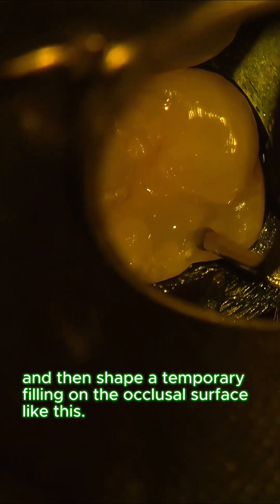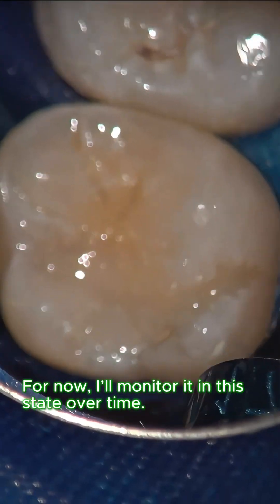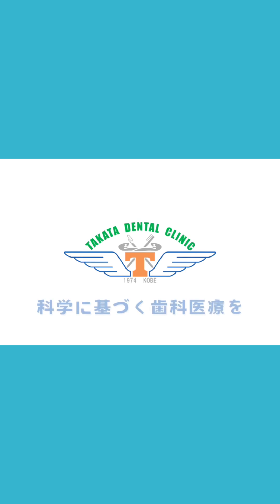First I seal the cavity, then shape a temporary filling on the occlusal surface. This is a temporary restoration for now — I'll monitor it in this state over time. Science-based dental care, Takata Dental Clinic.